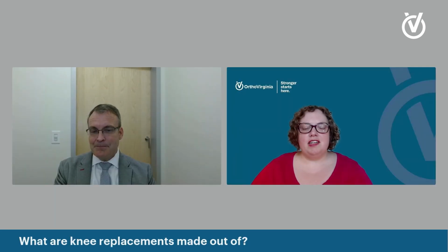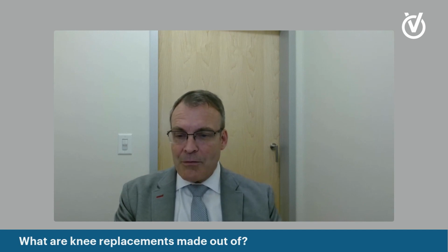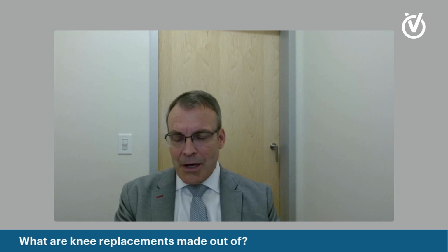Thank you. What are knee replacements made out of? So two things. The thigh component of the knee replacement is made out of cobalt chrome. The lower leg portion is made out of titanium, and the spacer in between is made out of a high-grade plastic called polyethylene. All knee replacements use these same materials in different degrees at all major manufacturers. I use a Stryker Triathlon knee replacement, but all the other major manufacturers use cobalt chrome for the thigh portion or the femur, titanium for the lower leg portion, and then polyethylene as the spacer.